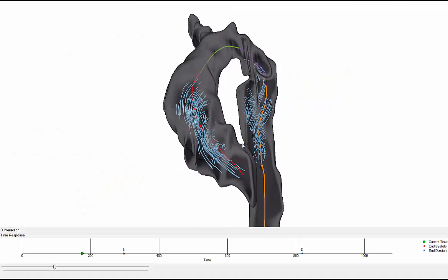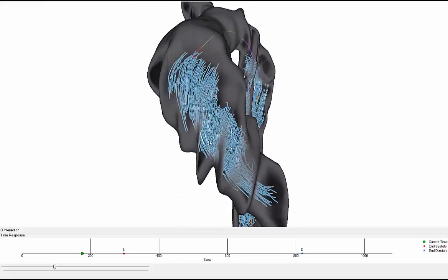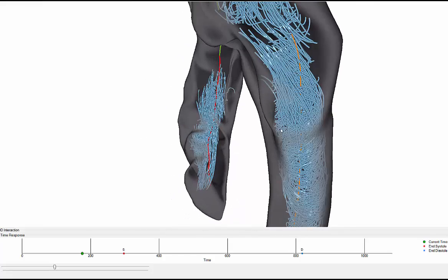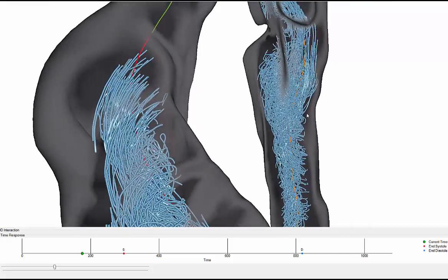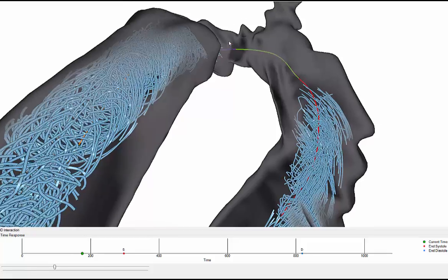The manual classification is a time-consuming, subjective, and error-prone process with a high inter-observer variability. For example, the determination of the vortex size is very complicated, because the domain expert needs a lot of interaction to see the vortex from all sides, and it is difficult to estimate the distance to the vessel wall.